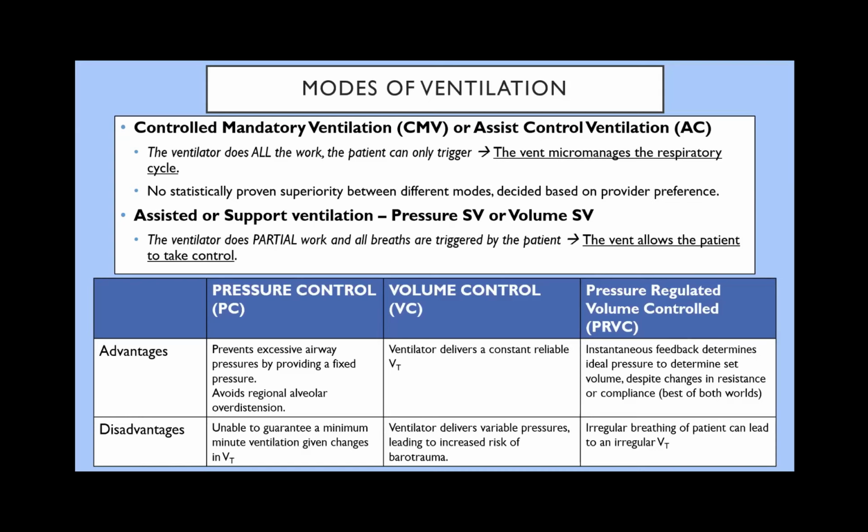And usually we only use pressure support or volume support whenever we are trying to do a breathing trial to see if they can be extubated, or when we're doing kind of like physical therapy for the lungs, or for people that we expect to be difficult to wean from the ventilator.